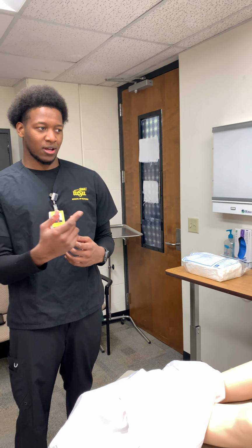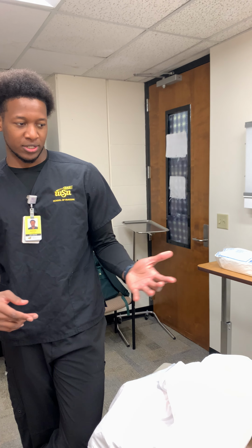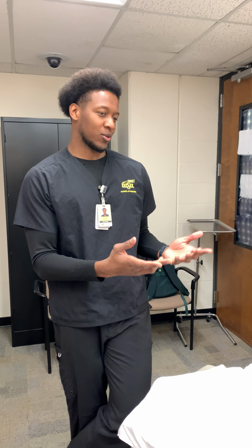After I let the patient know about that, I also want to know if the patient is allergic to iodine or latex, because those are two things we'll be using today, and we would not want this patient to have an allergic reaction to it. No, I'm not allergic. Perfect, thank you.